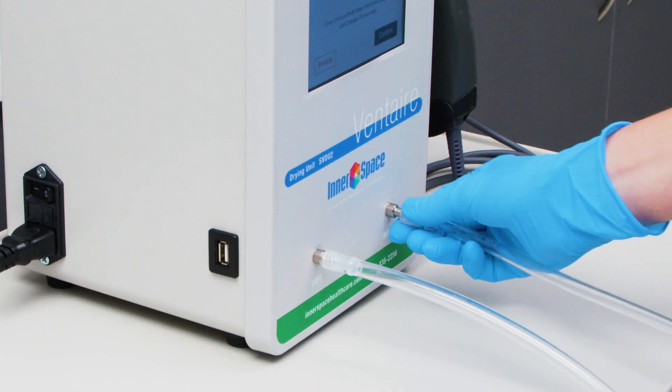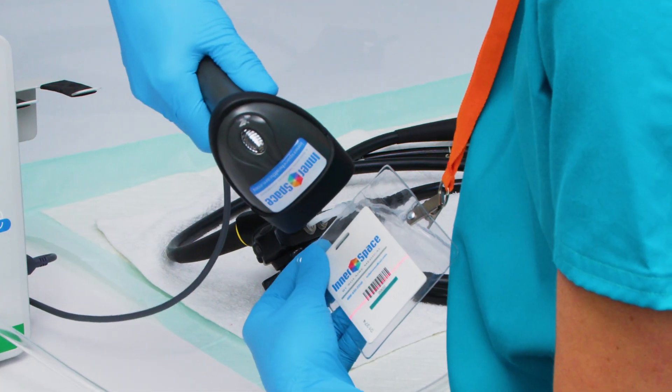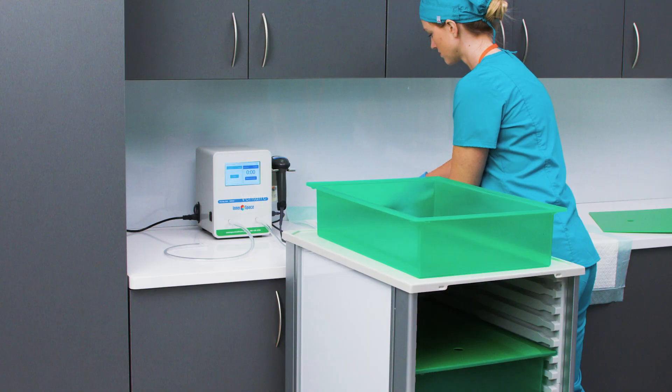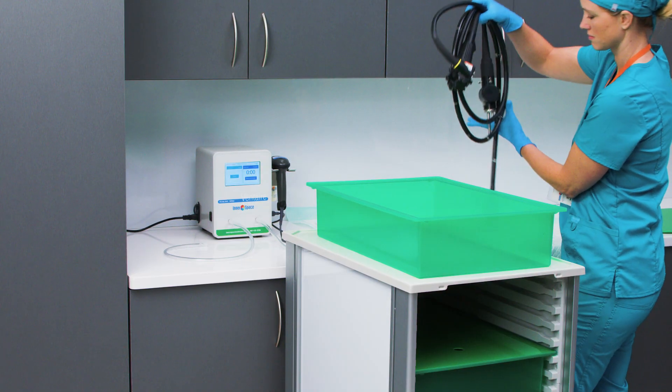Just start the Drying Unit, attach the tubes and connectors, scan the barcodes on the badge and scope, and then select Start to begin drying. When the drying is complete, remove the scope.